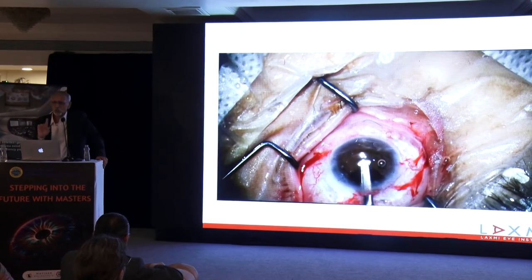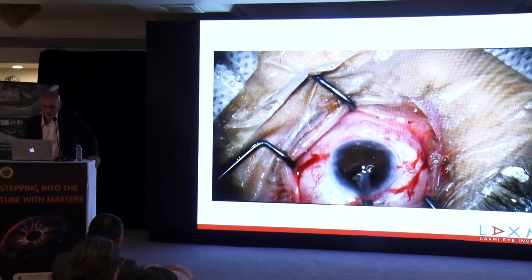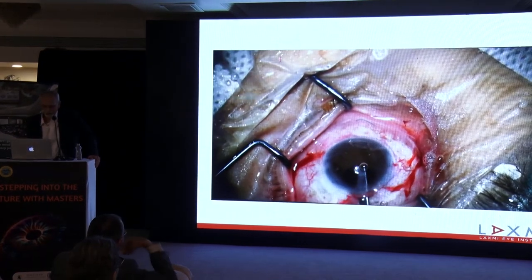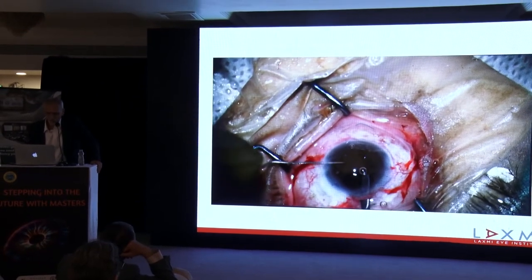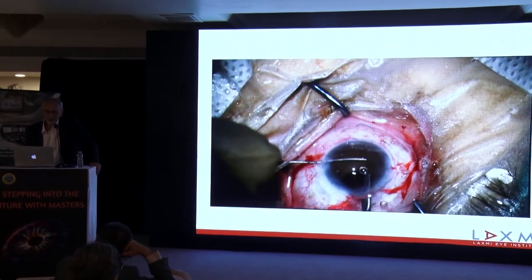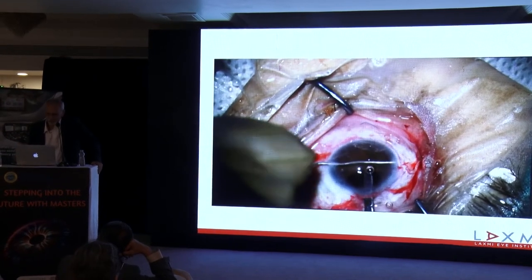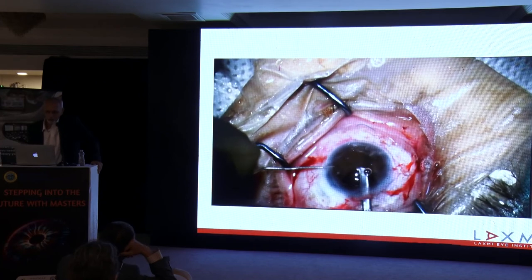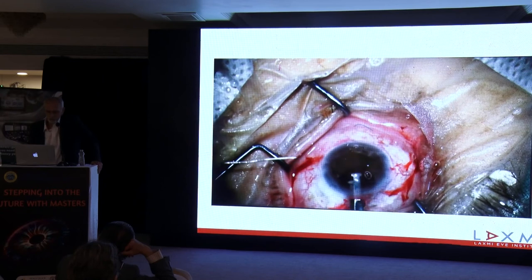Then, the only option for me, if I know I have to visually rehabilitate, was to go back to our own favorite technique, and that is iris clip. After seeing how Dr. Daljit Singh has done iris clip in eyes where there was hardly any iris left, you know these are all cakewalks. I just had to create a small pupil there once the lens was in place.